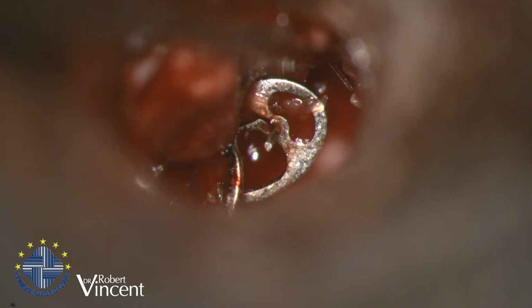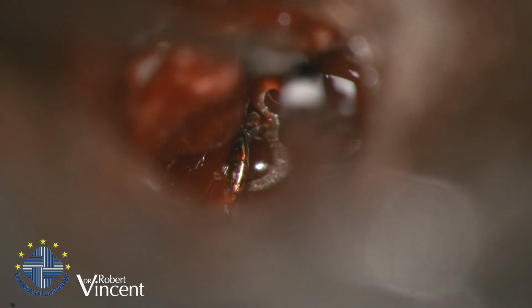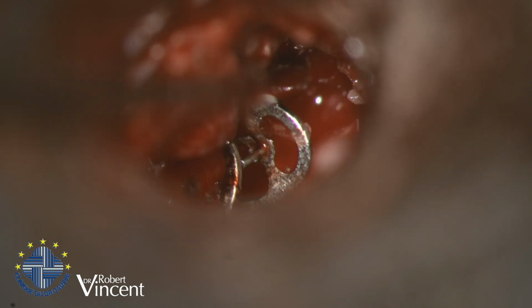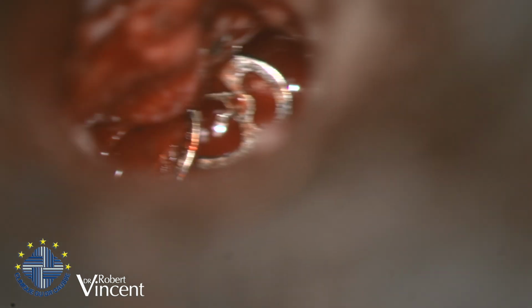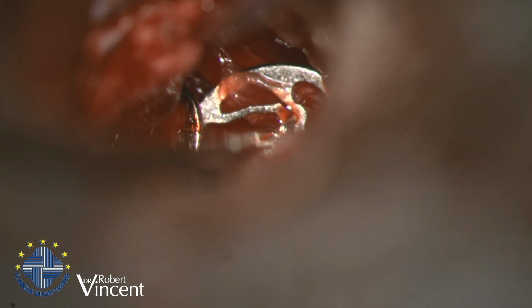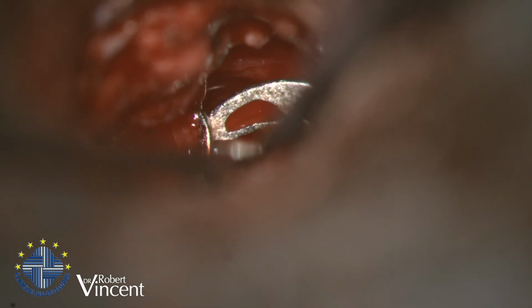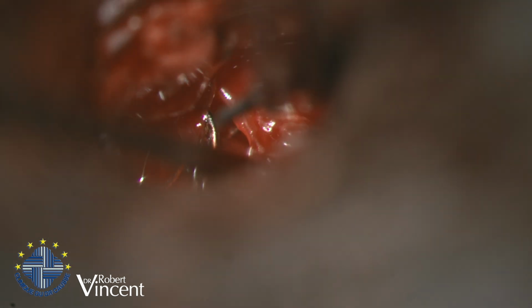Scissors. But it's better to remove it. I've seen cases like this. Calmez, s'il vous plaît. So I think I'm very near to be able to remove it, but I think there are still some adherence anteriorly. Un ciseau, s'il vous plaît. Some important, huge adherence.